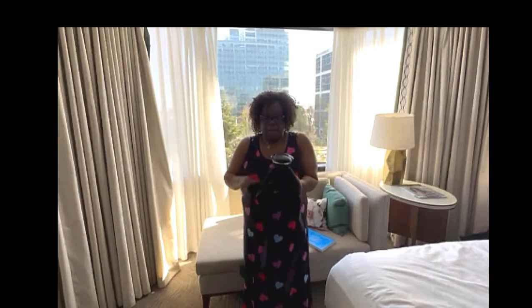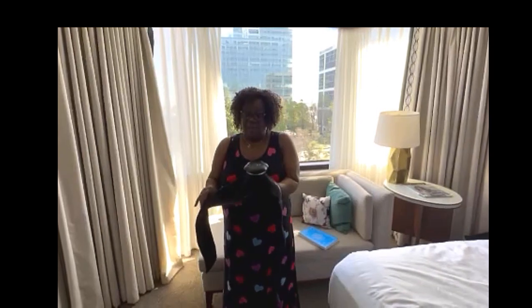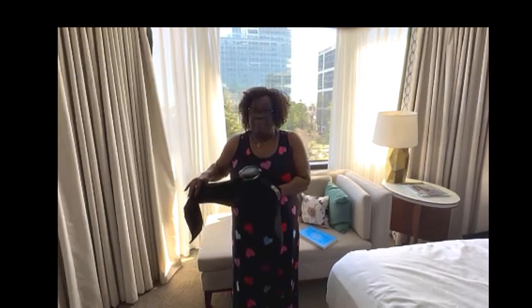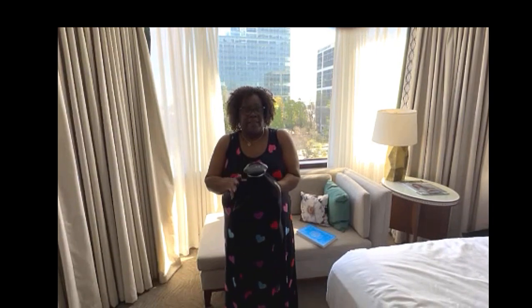I love this pack particularly because I just had back surgery not too long ago and this has been amazing in my recovery. This particular brand is good for the back and the hips.